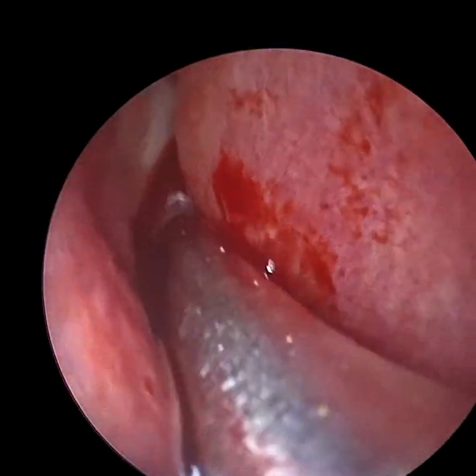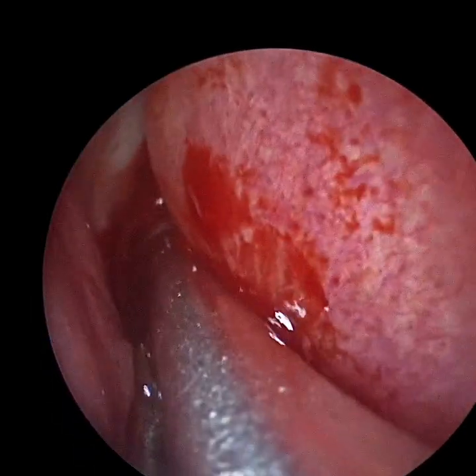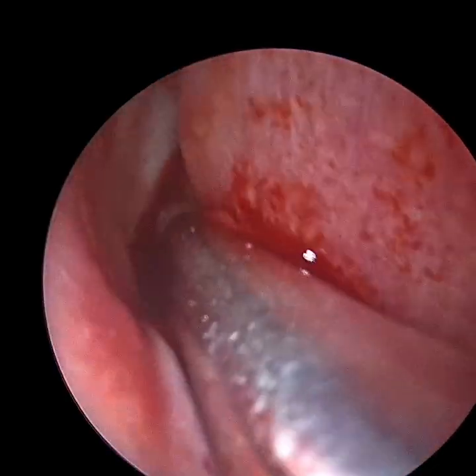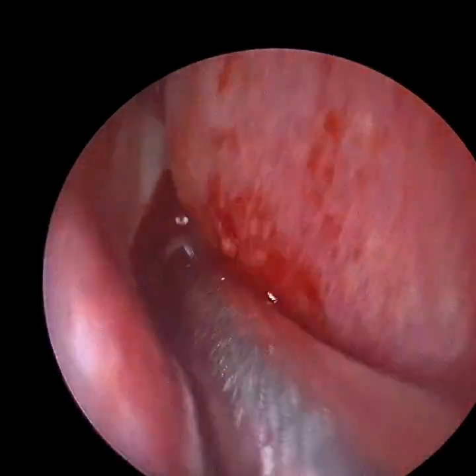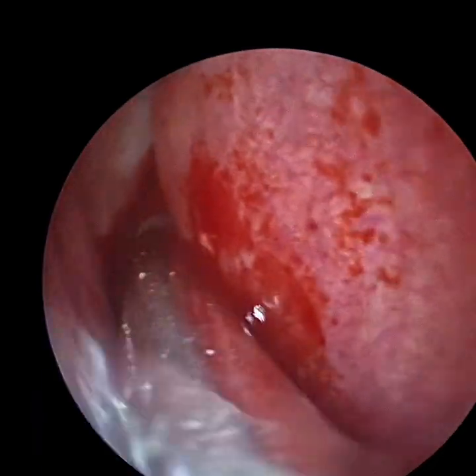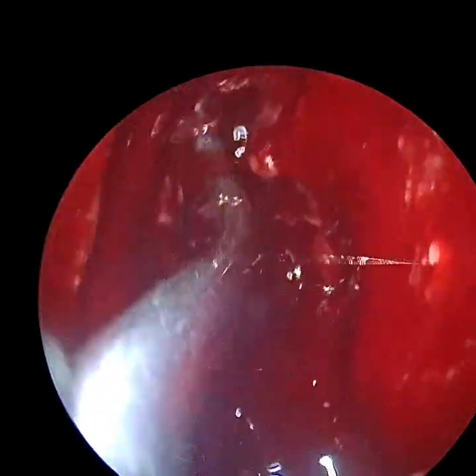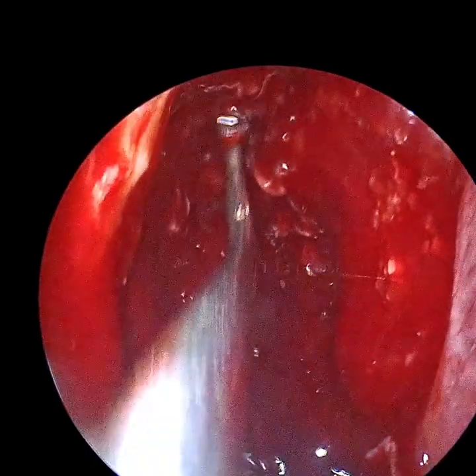So transaxillary drilling of the nasofrontal beak is a very useful technique, along with the placement of a nasal stent, that is a mometasone stent. So it gives a long-standing relief to the patient. So here, we are using a curved burr and we are taking away the nasofrontal beak. So this very difficult nasofrontal beak was there. So we took almost 5 to 6 mm or even more than that of the nasofrontal beak.